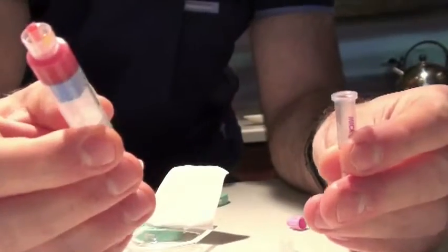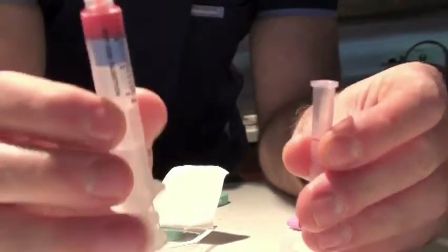Then you take this blood — which here looks surprisingly like V8 juice — and drip it into your little blood bullets. These will not clot.